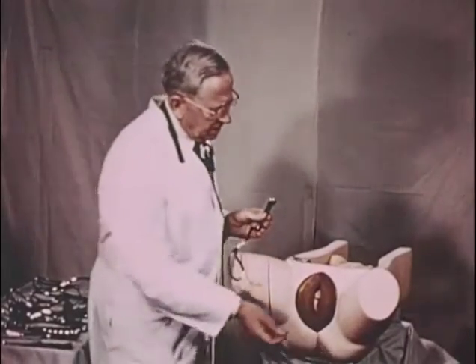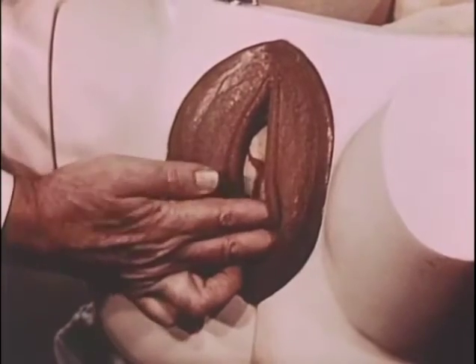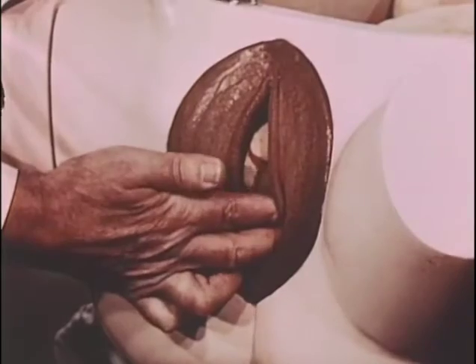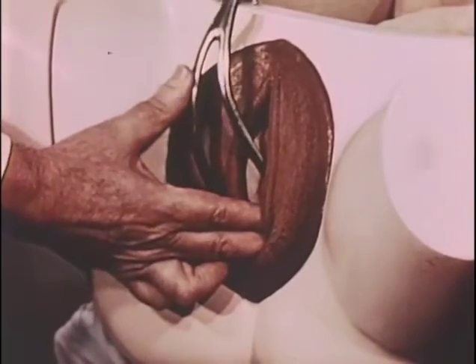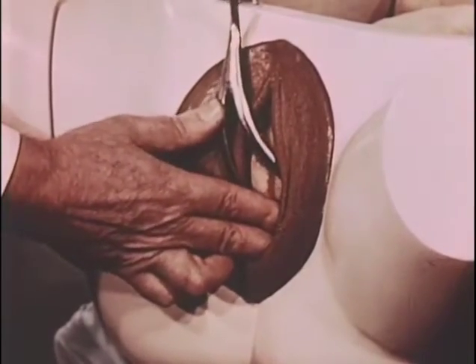The tips of the index and middle finger are inserted over the perineum behind the posterior parietal bone to act as a guide for the introduction of the toe of the first blade, the posterior or left blade, going to the posterior or left ear.